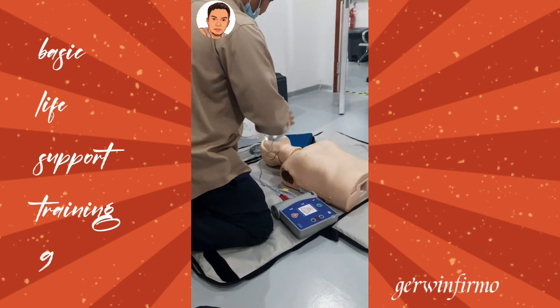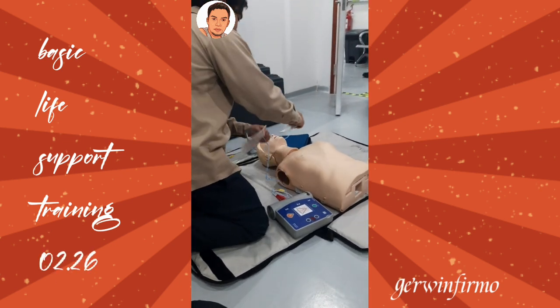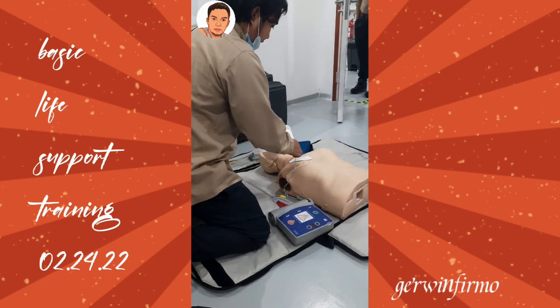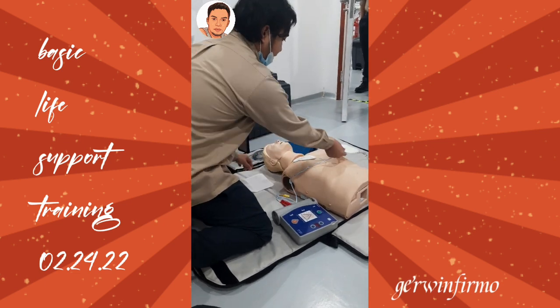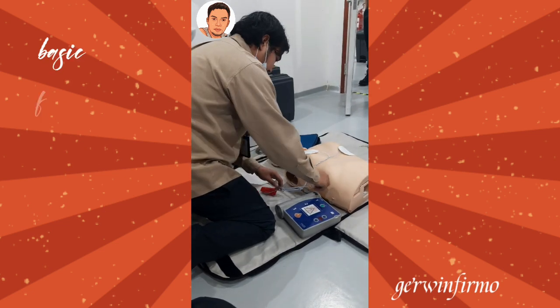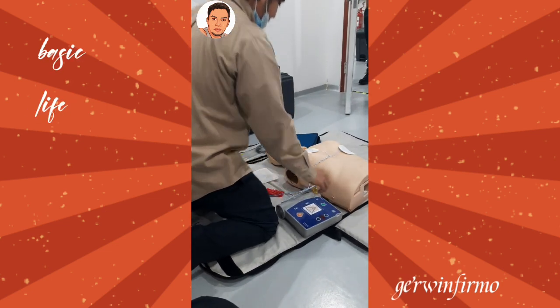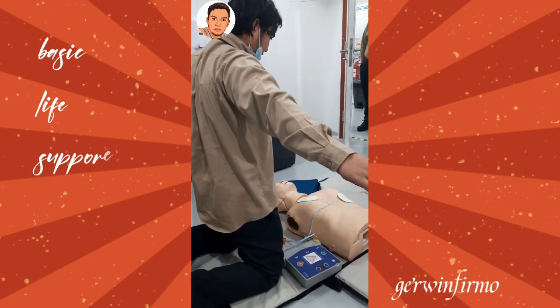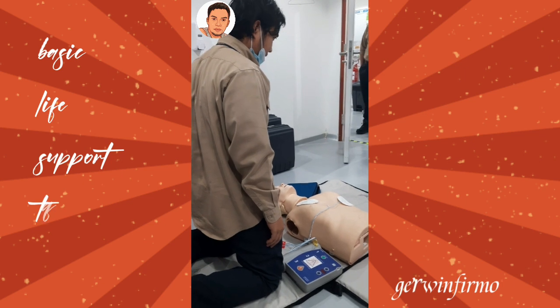Apply pads to patient's bare chest. Plug in pads connector next to flashing light. Plug in. Apply pads. Plug in connector. Analyzing heart rhythm. Clear.